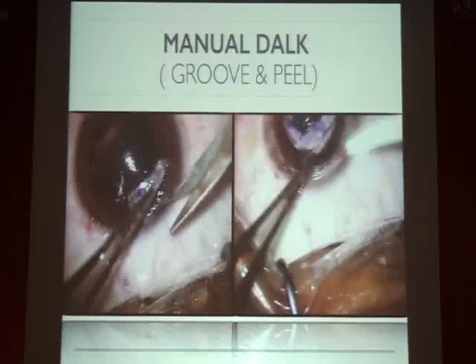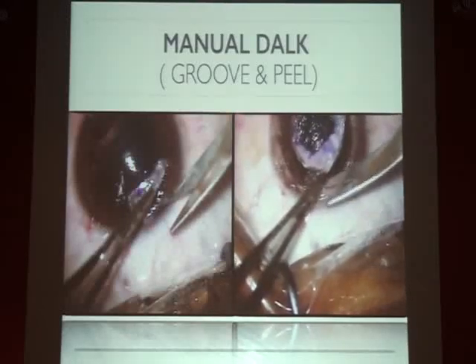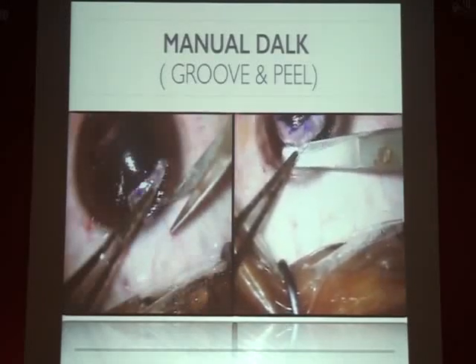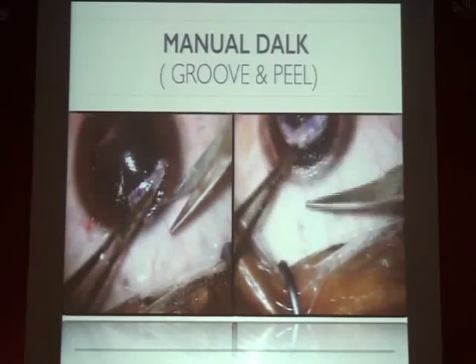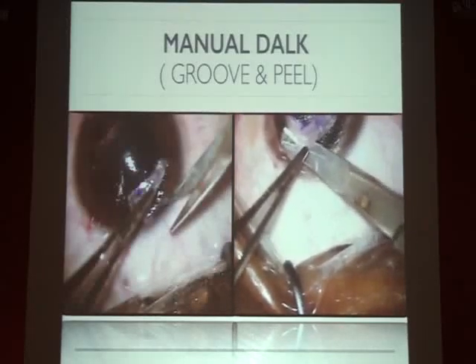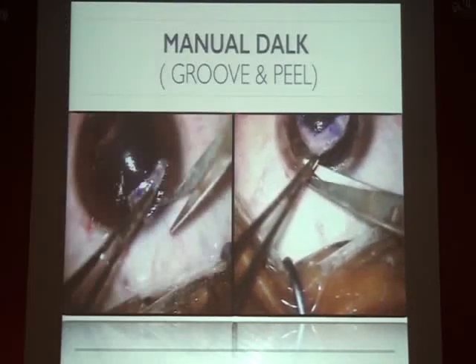And once you've done that, you basically do a blunt dissection using a scissor all around underneath your demarcation mark. So you make one complete round, then you go in a deeper plane. So you keep going peripherally and dissecting with a scissor like this. The advantage of using this is a universal cornea scissor. This is a blunt tipped instrument, so it's quite safe, and you don't cut till you actually see that you have separated that plane. And because the curvature of the scissors is pointing anteriorly, you don't really rupture the Descemet's membrane very easily.